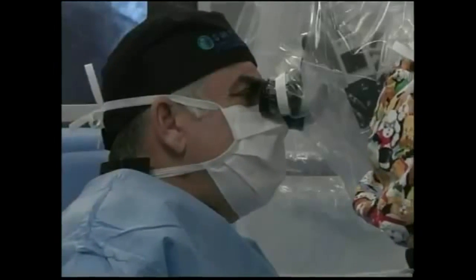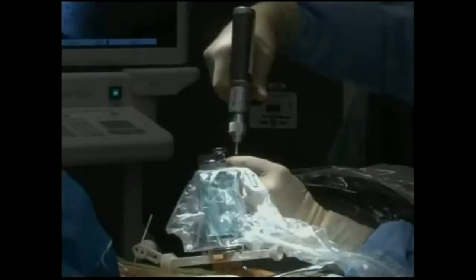Then, during the operation, it guides surgeons on where to place the hardware. The doctor says the free-hand technique can be up to 5% off the mark. The robot gets him within one millimeter. The safety factor is huge.